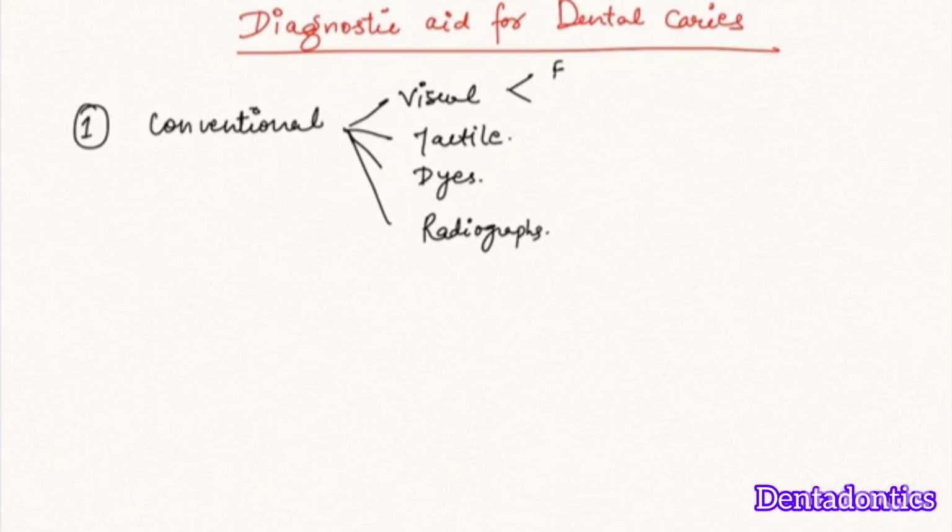The visual examination can be done by eyes or lens, and in visual examination we usually see color and texture, and it determines the qualitative destruction of the dentine, and the clinical accuracy is 25 to 30%. According to ADA, it can be no caries, initial caries, moderate caries and severe caries.